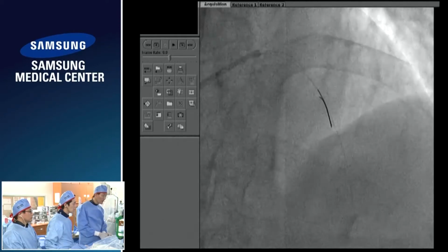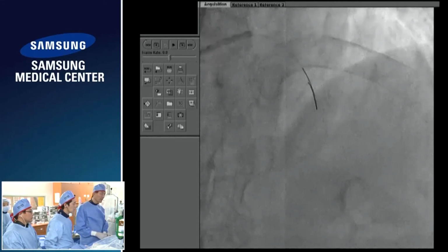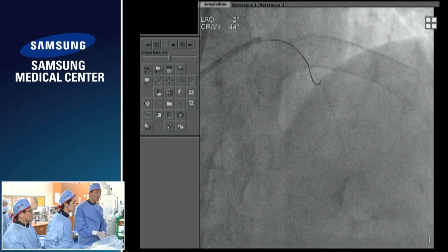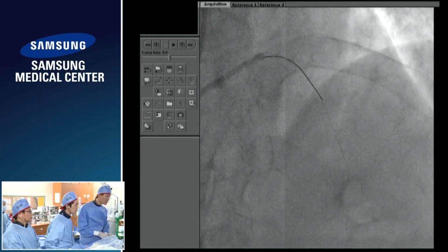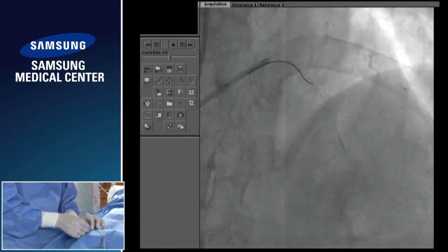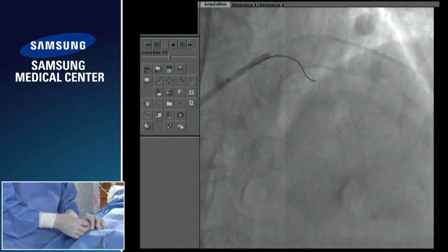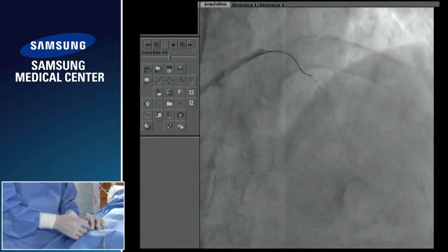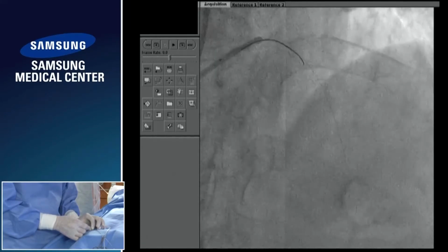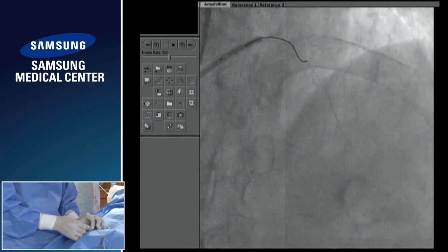Okay, this is the re-entry wire prolapse technique. You can see the wire prolapse technique. This avoids the wire undermining an undersized scaffold proximally. Okay, looking at as distal as possible, not always possible. To be frank, side branch wiring after BVS implantation is more difficult than bare metal stent because of the large dimension of the strut again.